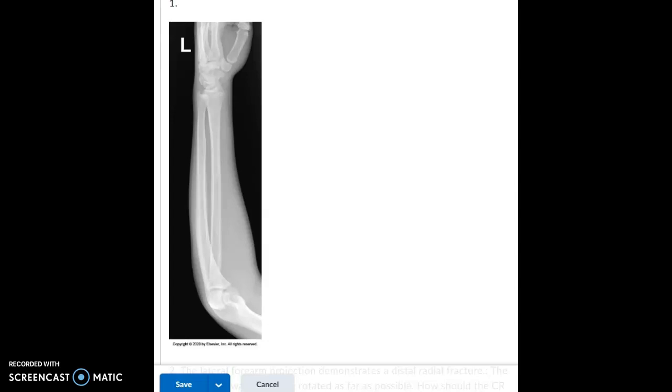So therefore, everybody was able to identify how to correct this except for one element. The shoulder for this projection was not in the same plane. So we needed to externally rotate that wrist, bring that arm to that 90-degree flexion that we like, and also make sure that the arm and the forearm and the humerus were in that same plane with the IR.